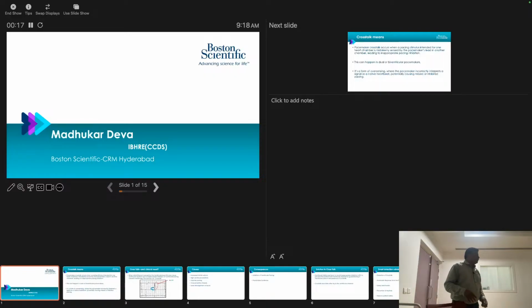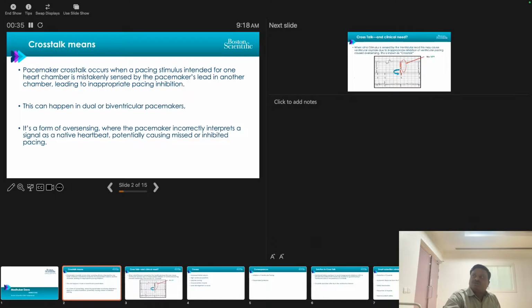Good morning, sir. Good morning, all. Thank you very much, sir, for the opportunity. So today I will take you through the crosstalk, which is very important to understand: what is happening, how this crosstalk is happening, and what are the remedies to overcome it.